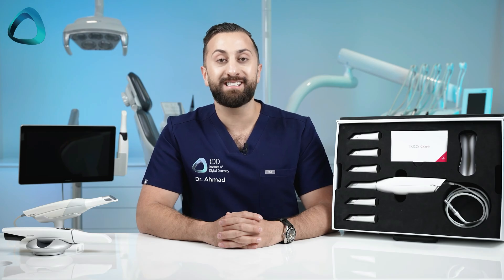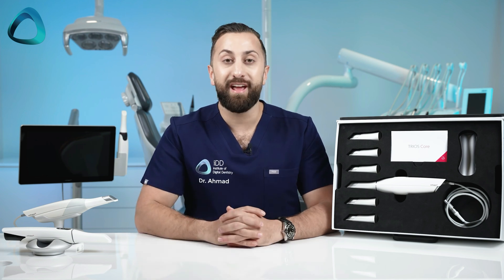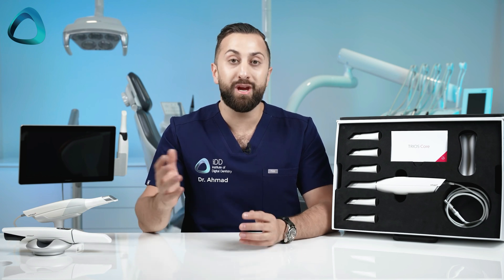So what are some of the differences between the Trios Core and the Trios 3, even the newly updated one? Well, one of the biggest things is the Invisalign connection — this scanner does not have the Invisalign connection. So if that matters to you, get the Trios 3. And if it doesn't, and you can't afford the Trios 5, then this will be your go-to Trios scanner.